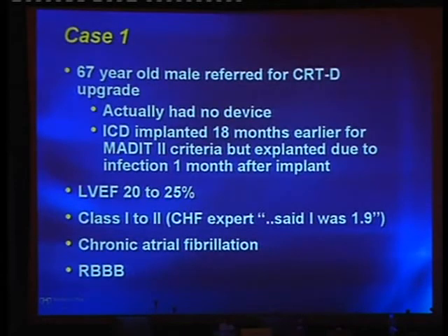Here, for those of you that probably are not familiar with the CARTO system, it really is very attractive. This is an accelerated representation where you're collecting points by just moving around point by point in the chamber of interest, and very rapidly you get the anatomical reconstruction of that shell as well as the electrical features that you can include. This is actually an atrium. The latest version is the CARTO 3, which we started using just less than a year ago, and this is really quite addictive. You just swirl around the catheter.